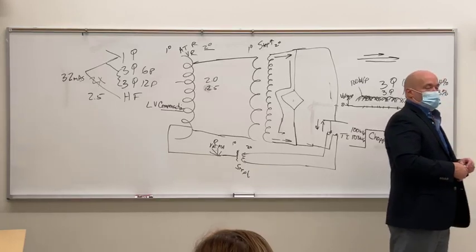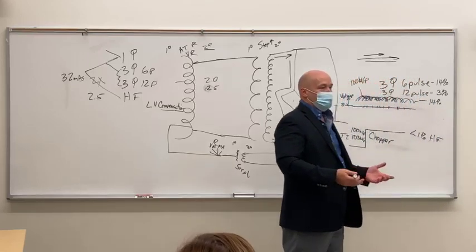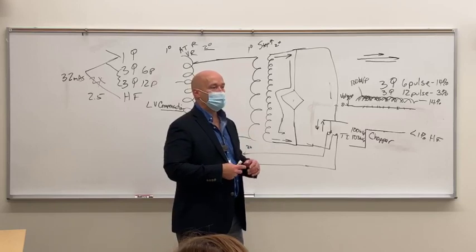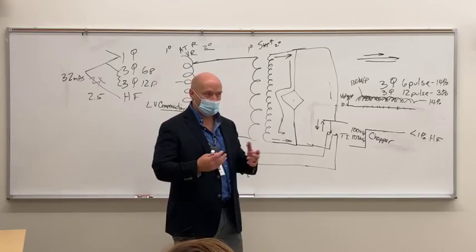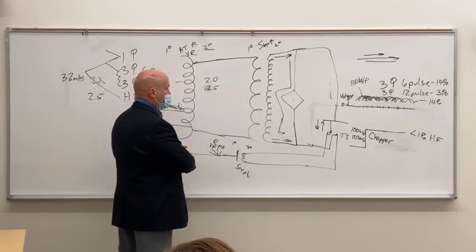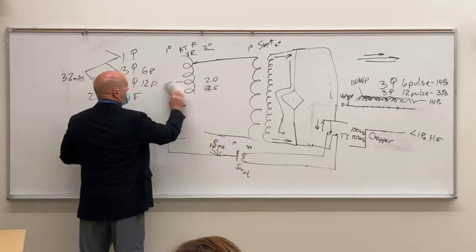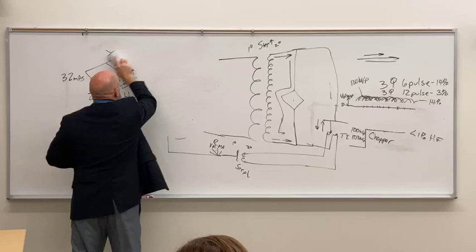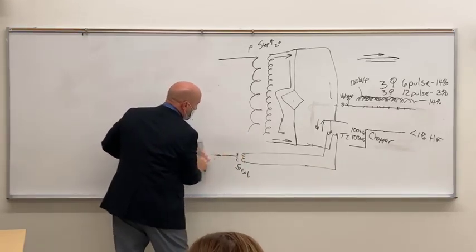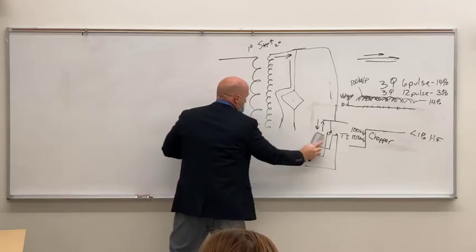No? There are some out there, and some of them use what we call capacitor discharge output units. So a capacitor discharge unit, a capacitor is kind of like a one-shot battery. All right?